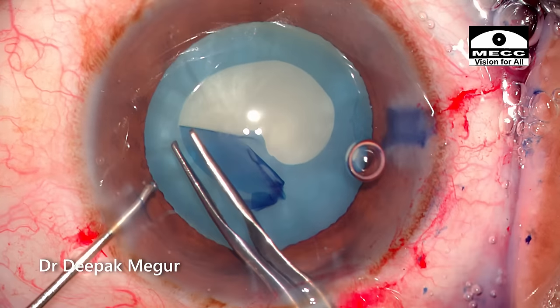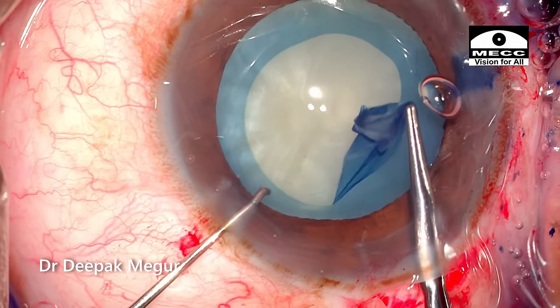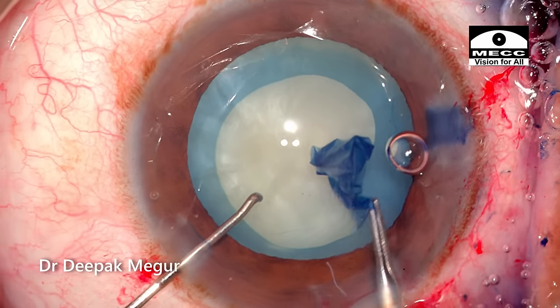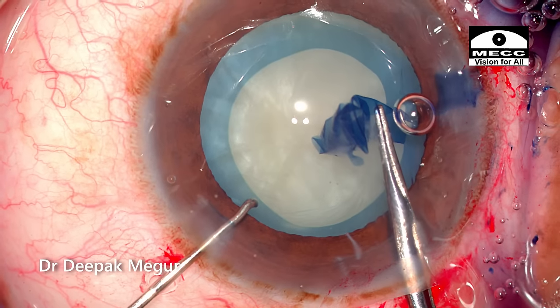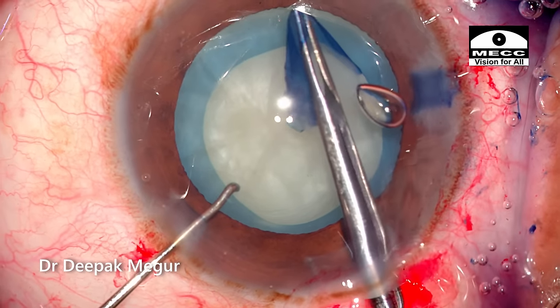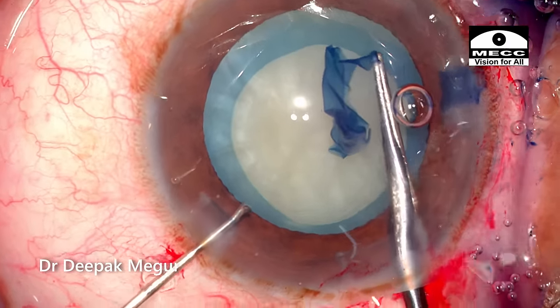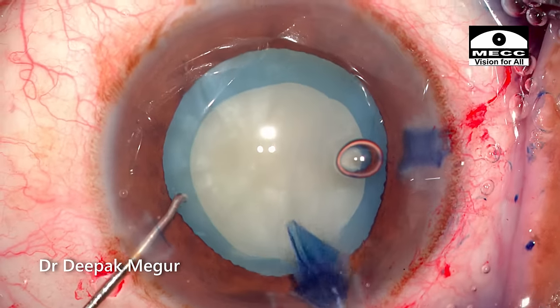This will help us in ensuring a better centrated rhexis. The flap is being torn in an anti-clockwise direction. Re-grasping the flap after a short span of tear is a good way to control the size and direction of the tear. I am aiming at a 5mm sized rhexis. I have not done the two-stage rhexis in this case as I was certain that the lens was not very intumescent. The rhexis is done.